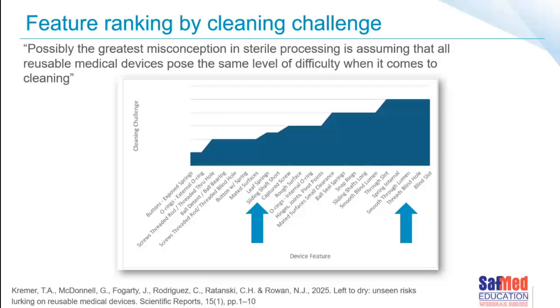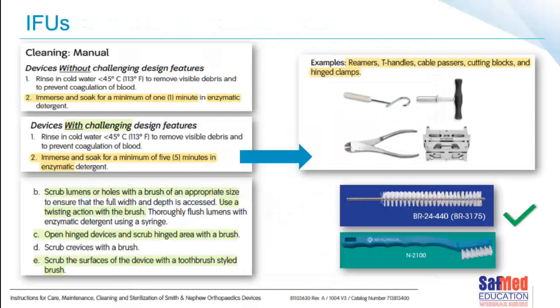So this research was focused on instrument geometry, and at the end of the day, helping manufacturers to learn when they design what they need to take into consideration to try and make the design of the instrument as easy for us to clean as possible, but also for us to understand scientifically what is difficult and what is the actual feature that is hardest to clean, to teach us about the cleaning.